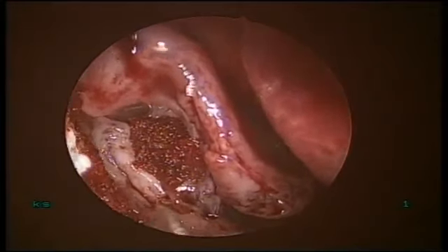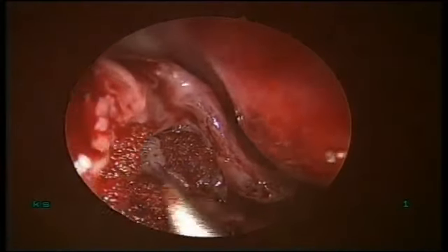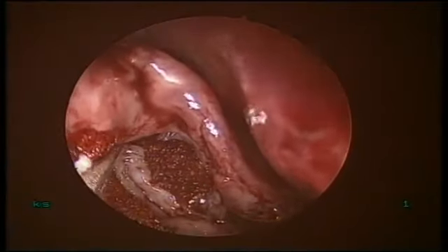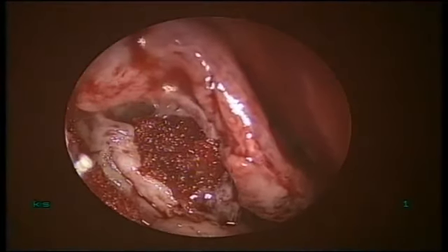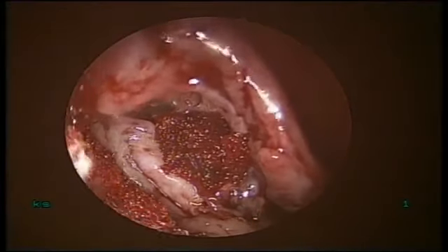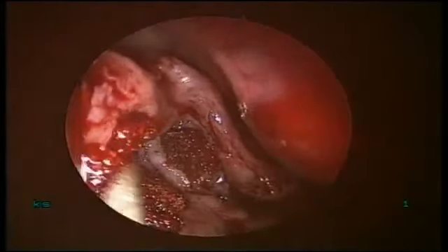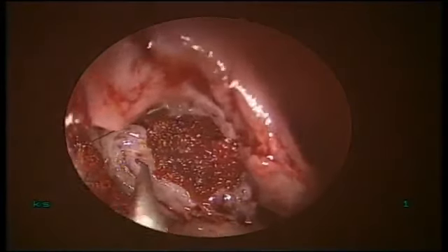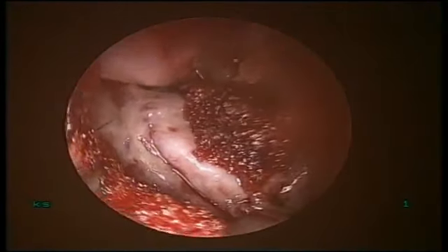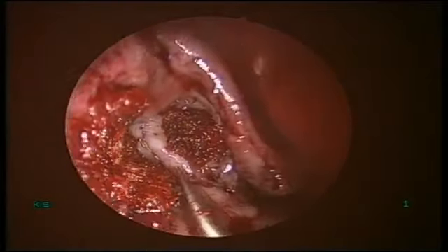So you don't do syringing intraoperatively? Yeah, in case I have a doubt, there is too much of thick discharge, then only. Here it is so clear cut.